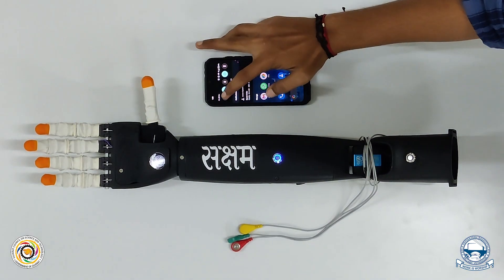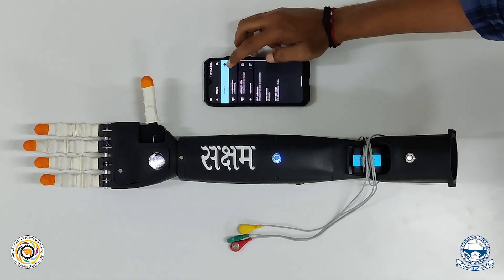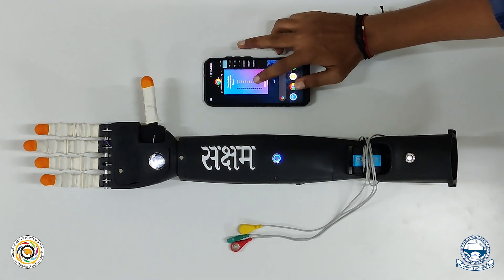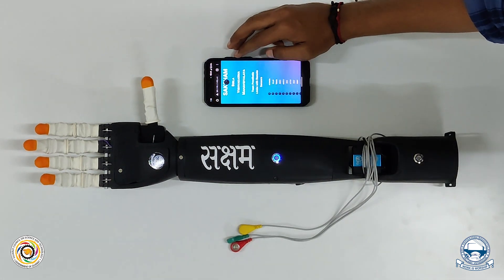Each finger can be easily actuated by the website application provided. This web app is equipped with a number of buttons that can be used to check a wide range of motion.